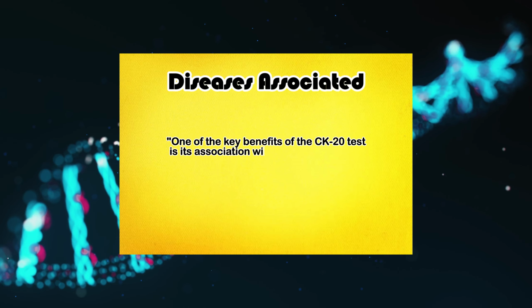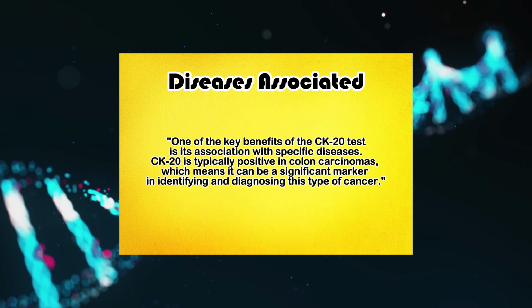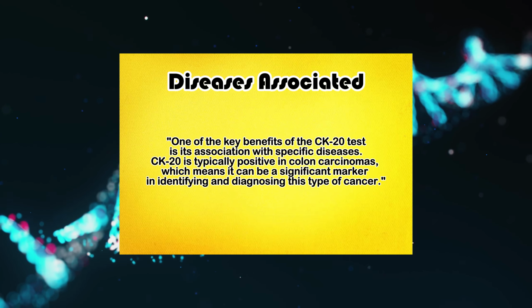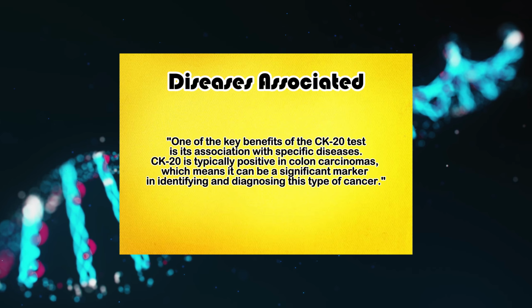Diseases associated. One of the key benefits of the CK-20 test is its association with specific diseases. CK-20 is typically positive in colon carcinomas, which means it can be a significant marker in identifying and diagnosing this type of cancer. Specimen used.